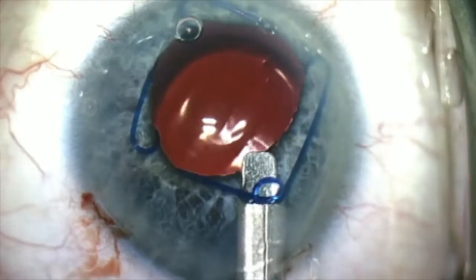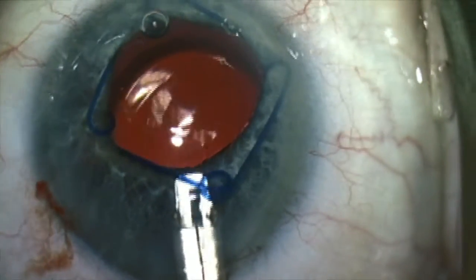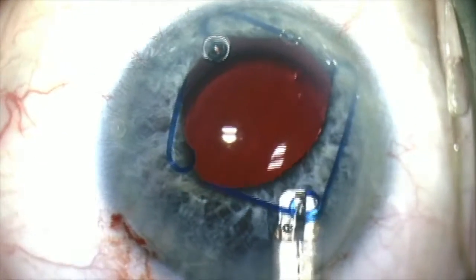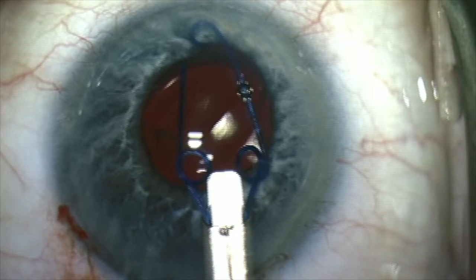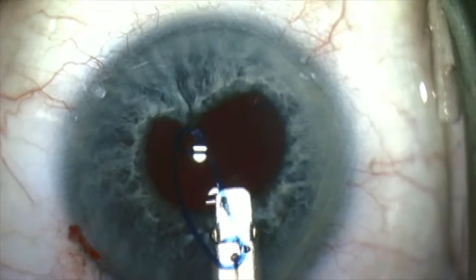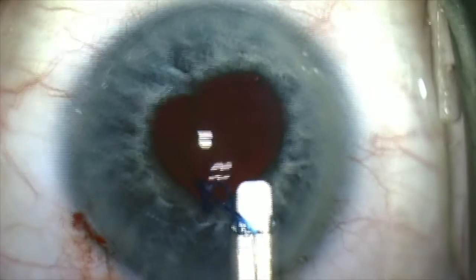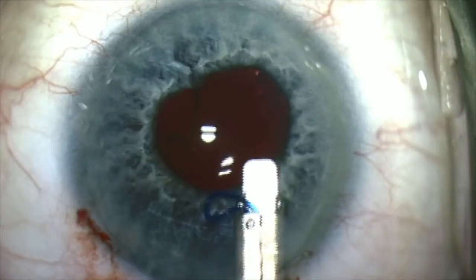To remove the Malyugan ring, I disengage the proximal eyelet, then go in with my Malyugan ring remover and stay in the eye until the entire ring is into the delivery system, and then get it out. This way it's safer for Descemet's membrane and you don't get a tear.